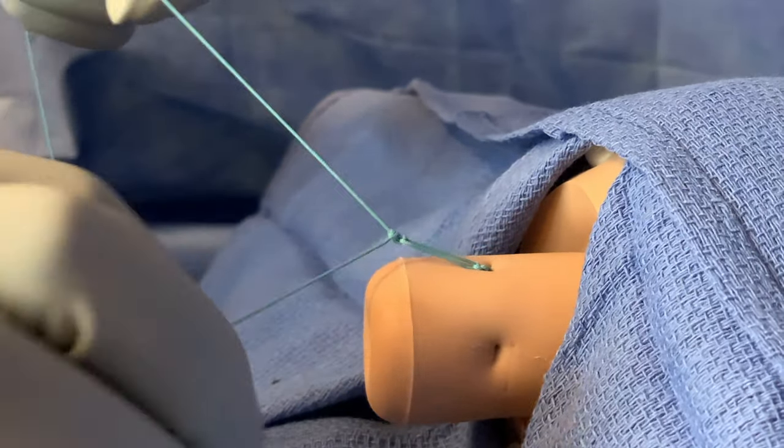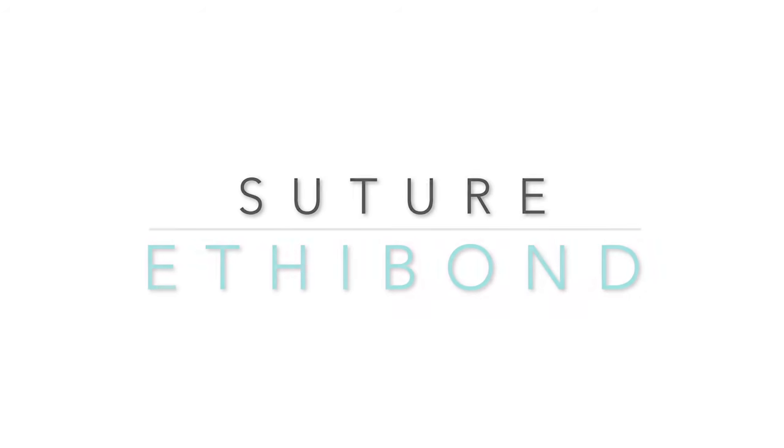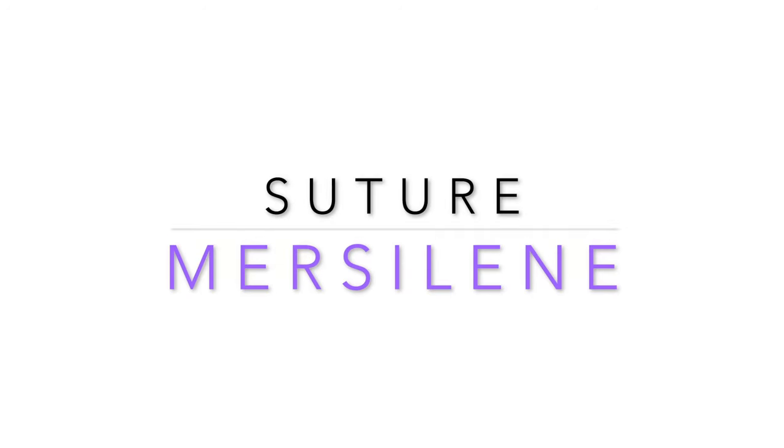Please see the demonstration in the cerclage removal video. In this demonstration, we use a green ethibond suture so the steps can be highlighted and visualized easily. As previously mentioned, the suture material used during an actual cerclage placement is based on surgeon preference. However, there are some important things to remember about Mersilene, which we will highlight as we watch Mersilene being used. We will not be verbalizing the other steps of the cerclage to allow you to review them silently while watching.